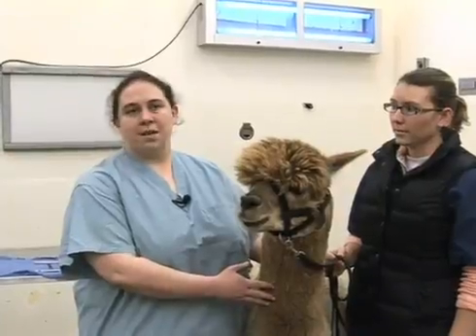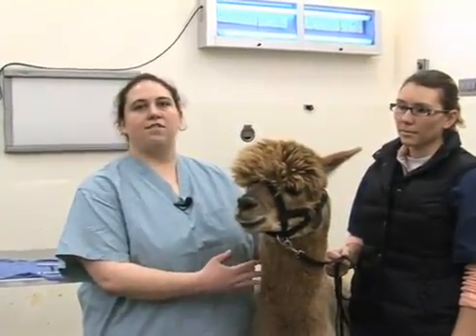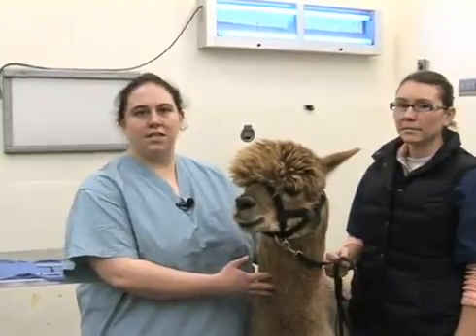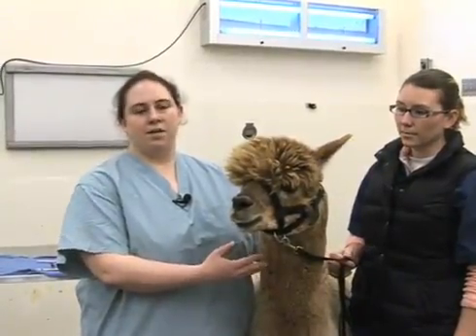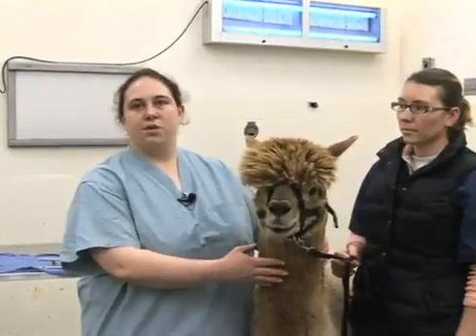Some animals may be robust enough and fractious enough that you may have to sedate them to do this, even with the giggle wire and handles. That may be something your veterinarian will need to assist you with if sedation is required.